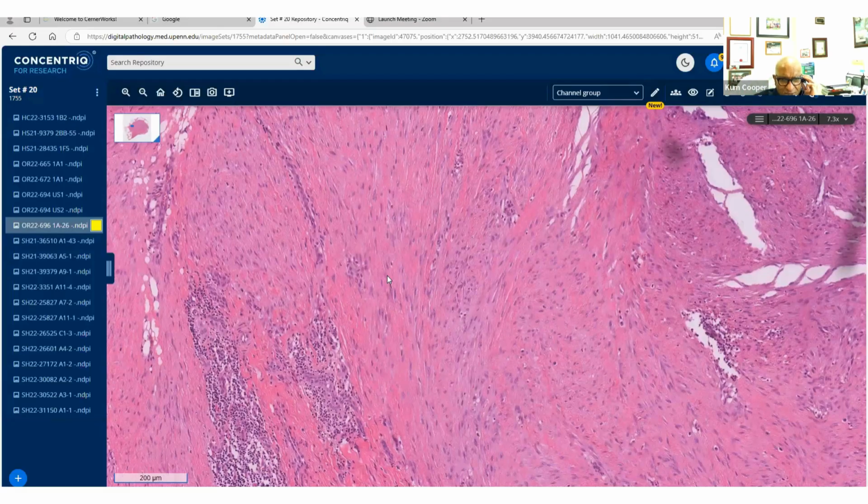This was a resection, it was proven on biopsy, so we did not do any stains, but I kept it in and put it on this set just for conversation, because not everything is rare. These are much more common, and these occur in the thigh. And I use the term desmoid type fibromatosis. That's my WHO terminology. So good question.